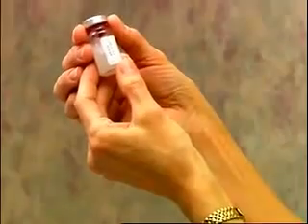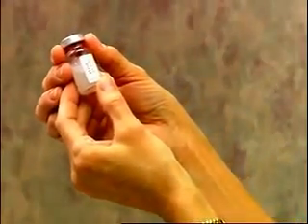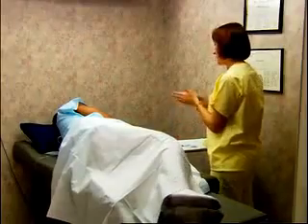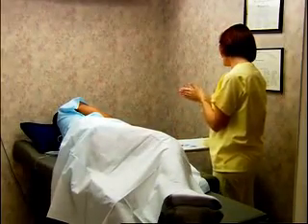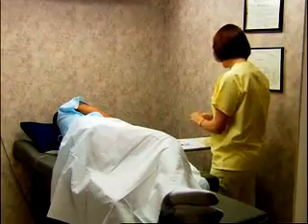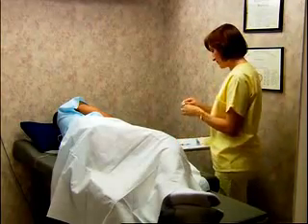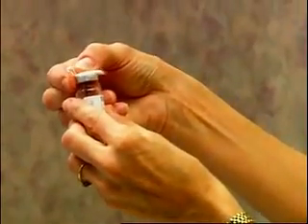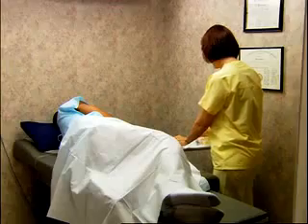Check the medication order and compare the name of the medication ordered with the label on the medication vial. If the medication has been reconstituted, roll the vial between your palms to mix a solution or suspension. Cleanse the rubber seal of the vial with an alcohol wipe. If the vial is unopened, remove the cap first and then cleanse the rubber seal.